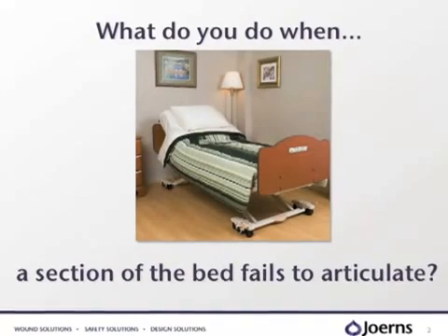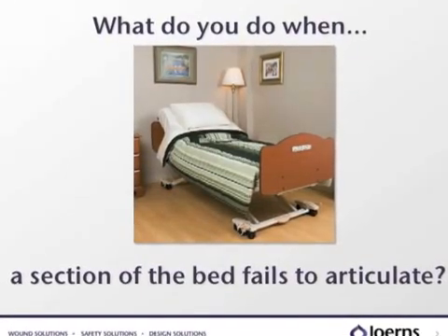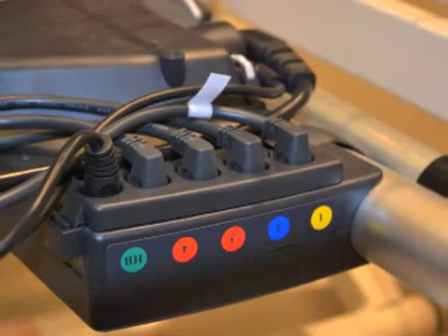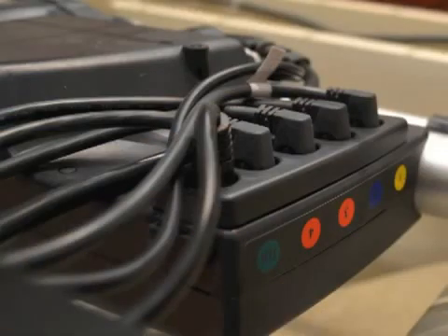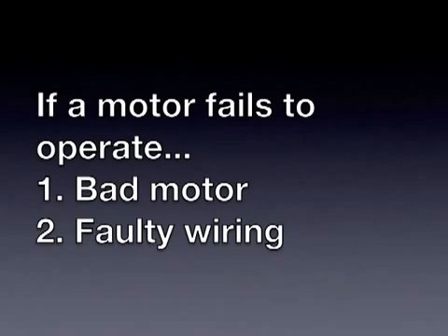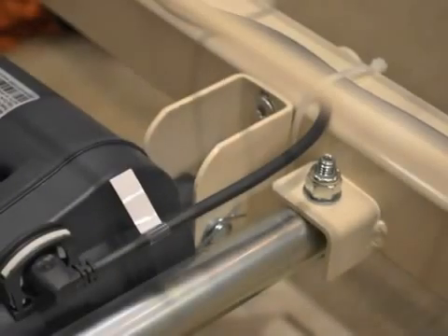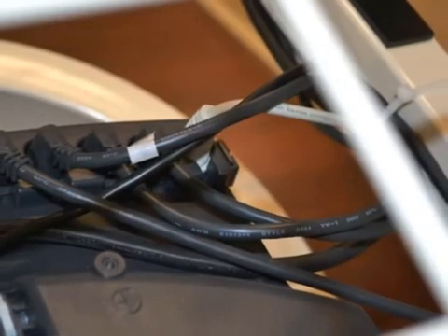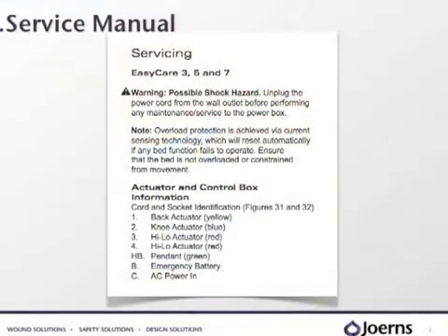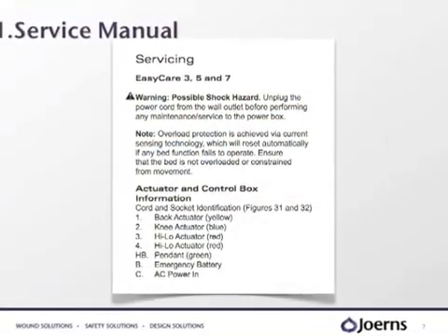What do you do when a bed fails to articulate at one single point? The EasyCare series has 4 motors that are all controlled within the control box, which is where our troubleshooting will begin and end. If a motor fails to operate, then the problem either stems from a bad motor or faulty wiring within the control box. To isolate the problem, trace the line running from the motor to the control box, or simply look in the user's manual, which lists where each line is running.